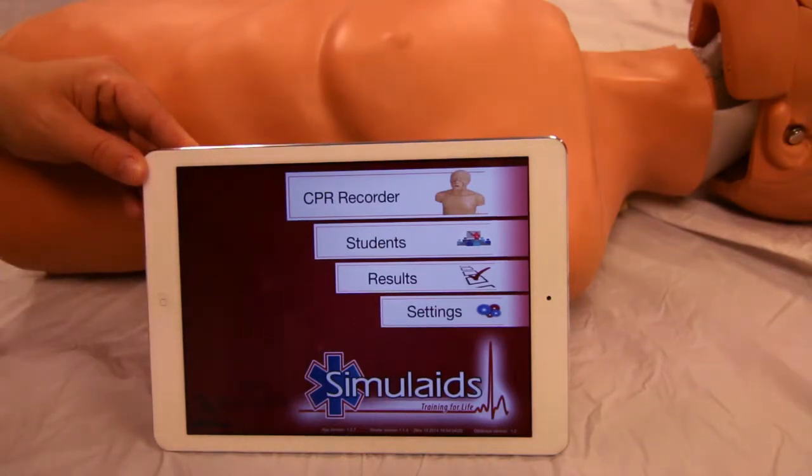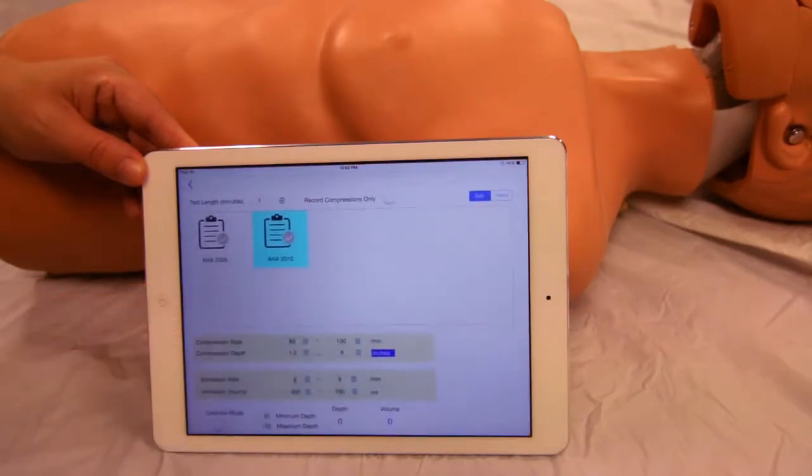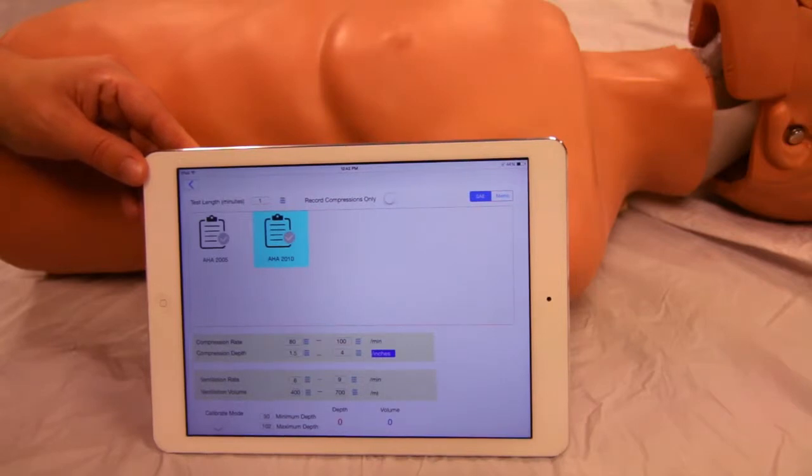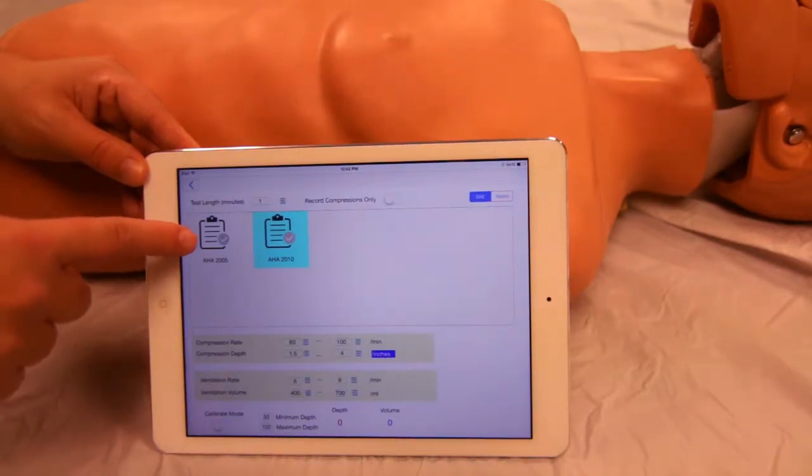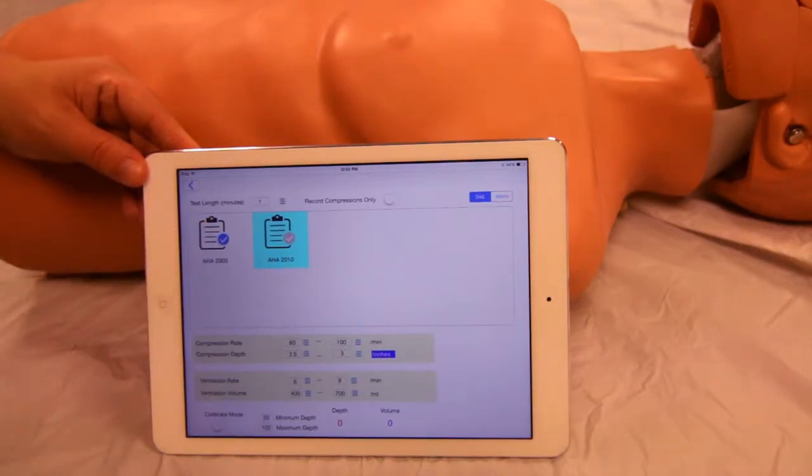First, select the setting you want to test to. Note the calibration button — this is only done at the factory and is accessed with a password. Default settings are available for American Heart Association 2005 and 2010; tap to select.